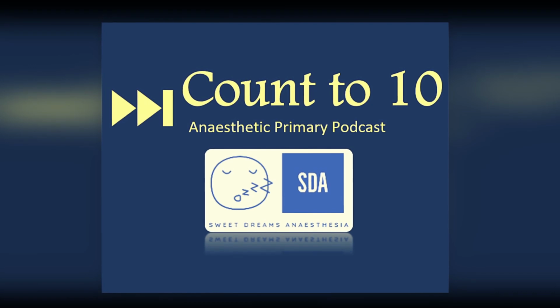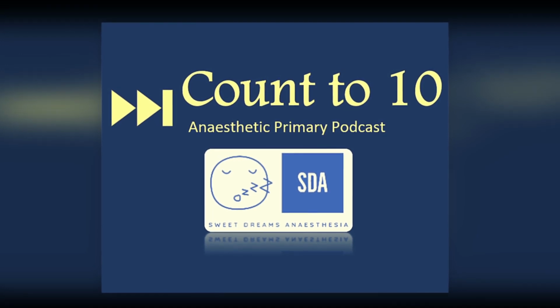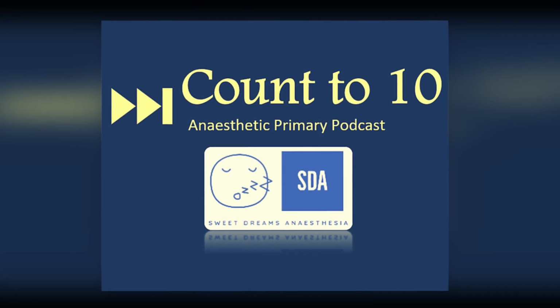A pulse oximeter is a probe that measures the amount of oxygen bound to hemoglobin in arterial blood and displays this as a percentage. It does this by applying two key principles.